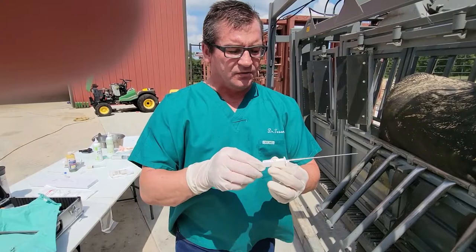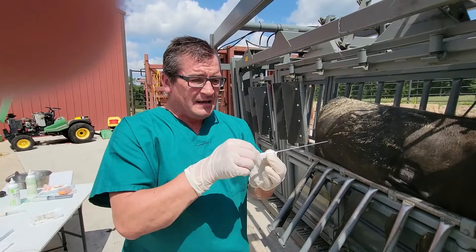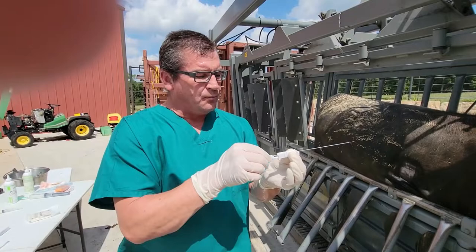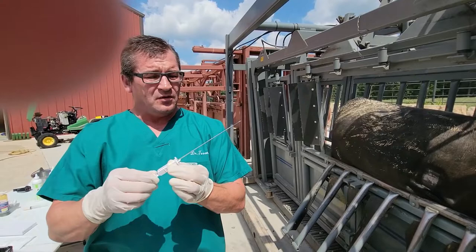It's important to work through this before you ever do a sample. We're going to go forward nice and steady — we'll probably feel a pop — and continue until we get to some real steady resistance. Once we feel that, we'll push the trocar, the inside part, forward where the sample is.